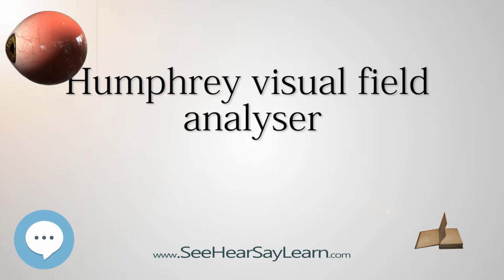The analyzer currently utilizes the Swedish Interactive Thresholding Algorithm, SITA, a formula which allows the fastest and most accurate visual field assessment to date. Results are then compared against an age-matched database which highlights unusual and suspicious vision loss, potentially caused by pathology.